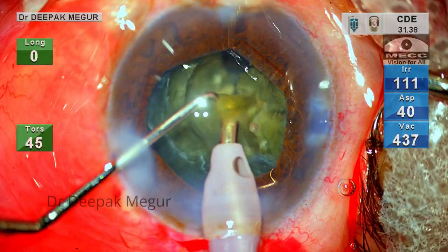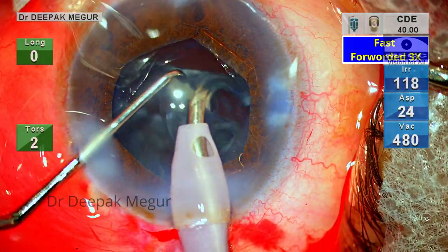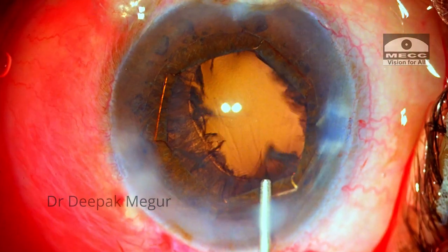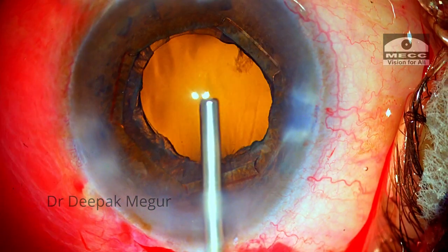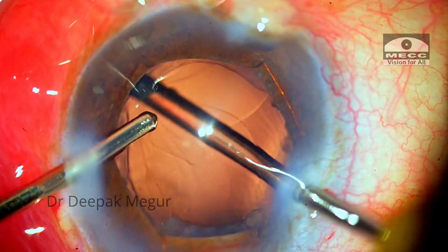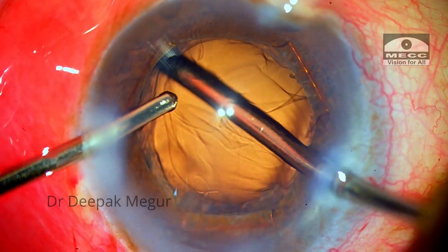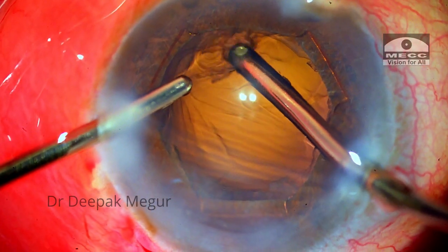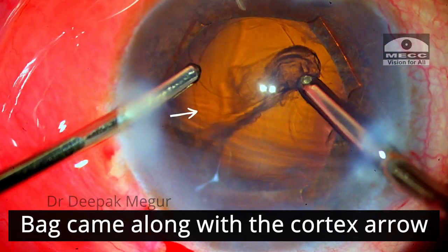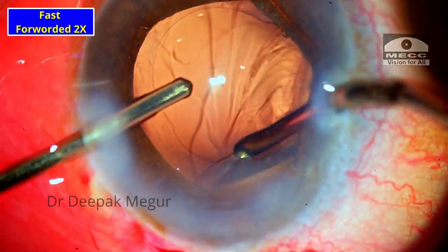I am fast-forwarding through the routine emulsification. Moving on to cortex aspiration — this is challenging, as there will invariably be very sticky cortex clinging to the bag in such eyes. After inflating the bag with viscoelastic, I carefully place my probe well below the anterior capsule, engage the cortex, and gently pull it out in a slight tangential manner at a posterior plane, careful not to engage the anterior capsule. The equator of the capsular bag comes close to being engaged in the aspiration port, but luckily it doesn't, and cortex aspiration is ultimately uneventful.